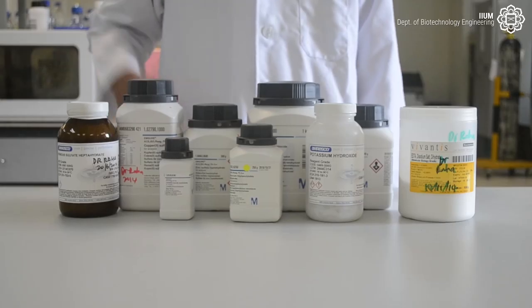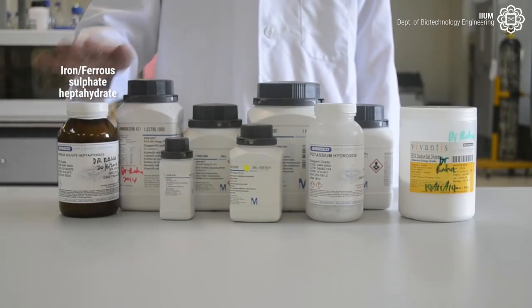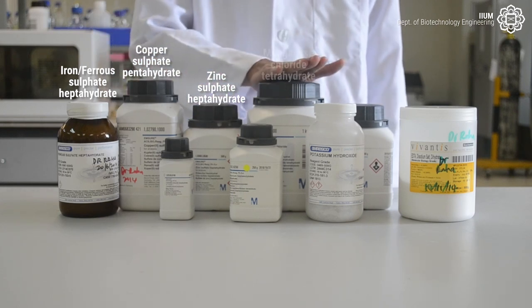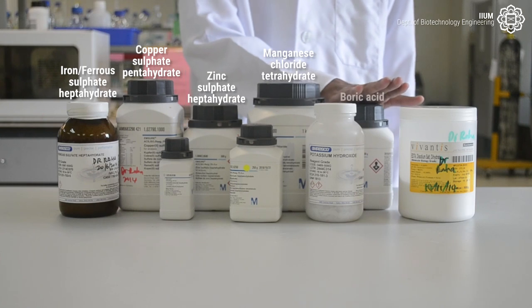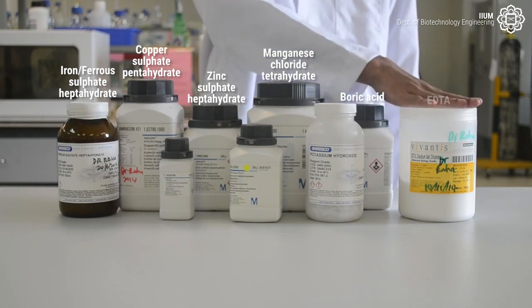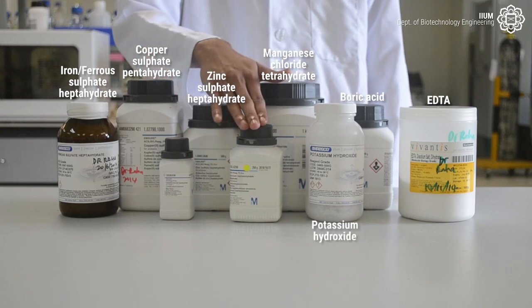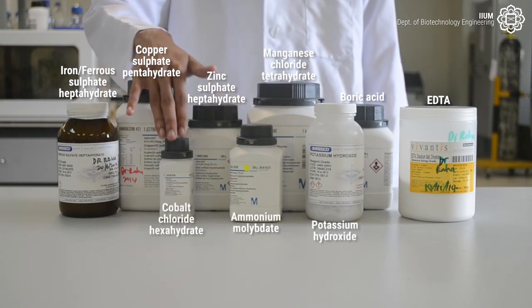For trace elements, we need iron ferrous sulfate heptahydrate, copper sulfate pentahydrate, zinc sulfate heptahydrate, manganese chloride tetrahydrate, boric acid, potassium hydroxide, ammonium molybdate, and cobalt chloride hexahydrate.